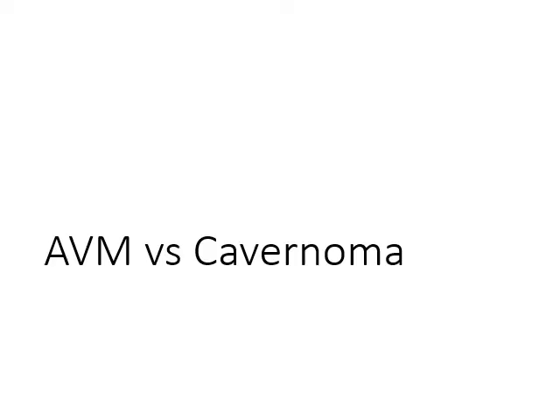So in view of the first fragment that shows a little bit of cavernoma-like features, I present to you some differences between AVM and cavernoma, because in the first fragment the features are more or less like a cavernoma, but there are some differences there.